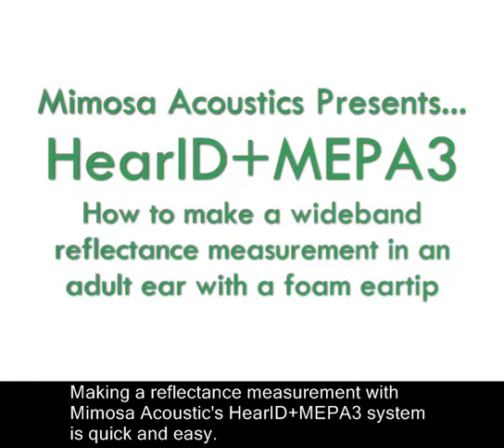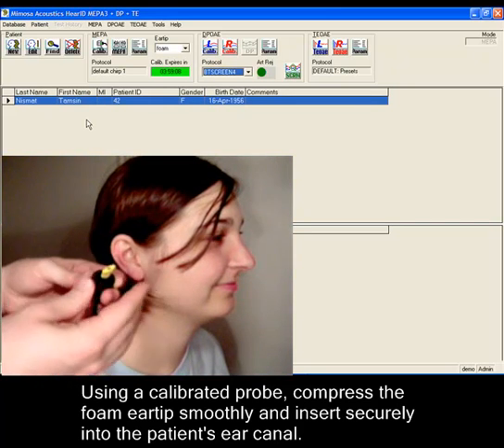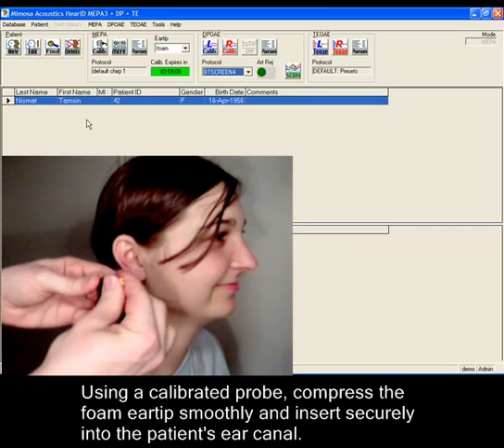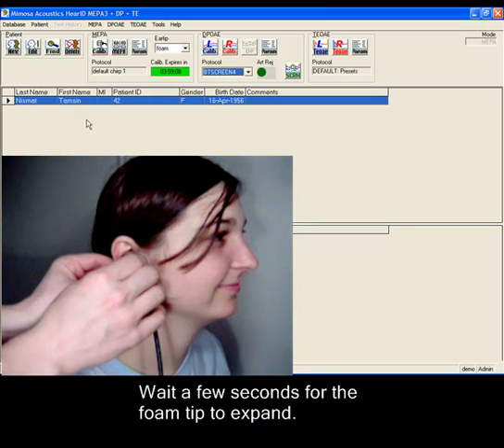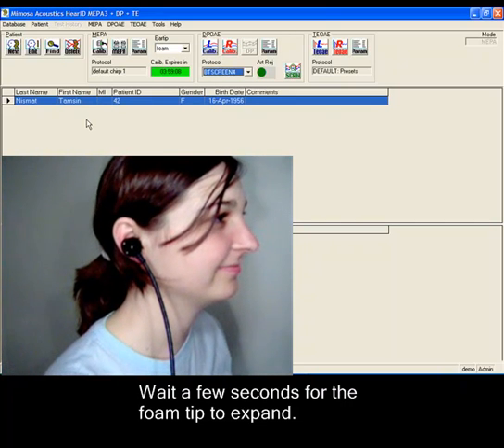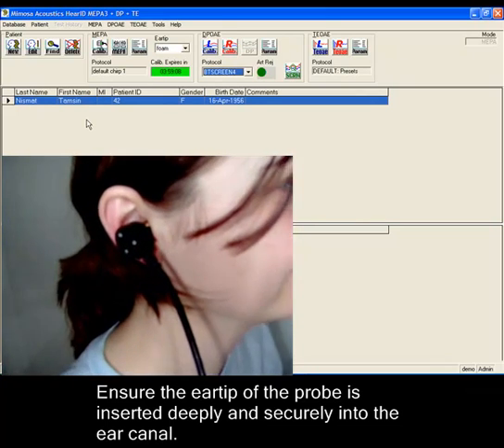Making a reflectance measurement with Mimosa Acoustics HearID plus MEPA 3 system is quick and easy. Using a calibrated probe, compress the foam ear tip smoothly and insert securely into the patient's ear canal. Wait a few seconds for the foam tip to expand, and ensure the ear tip of the probe is inserted deeply and securely into the ear canal.